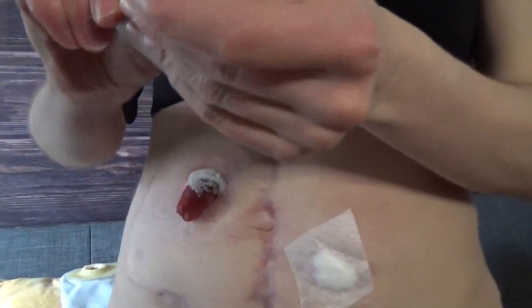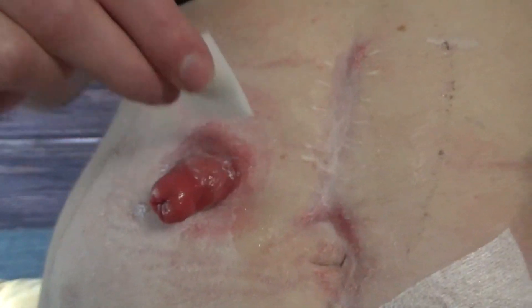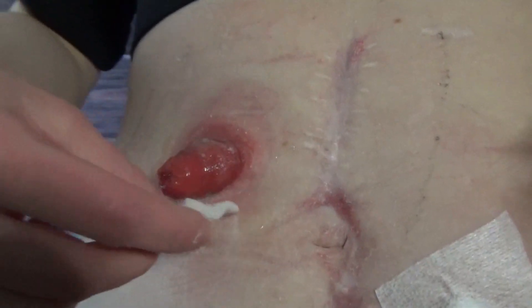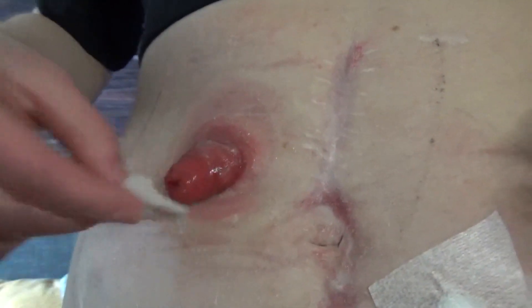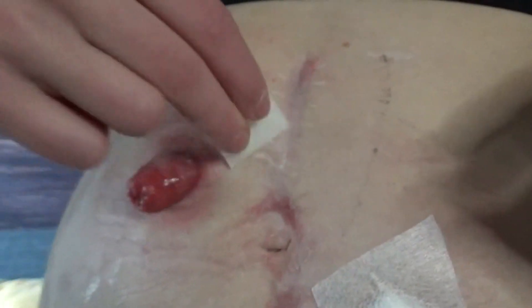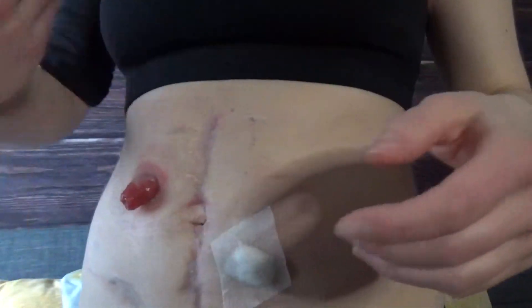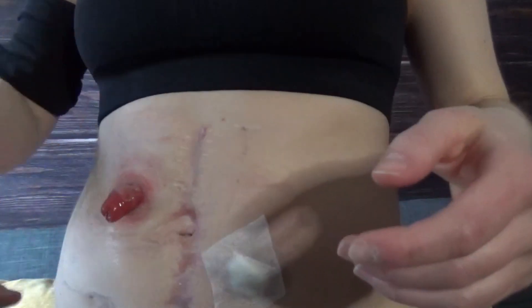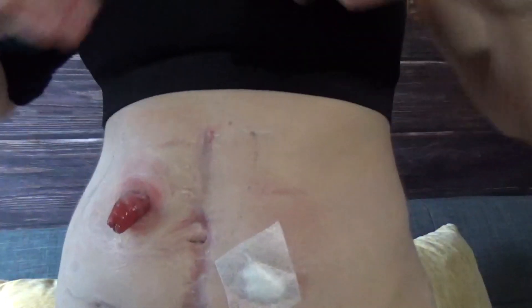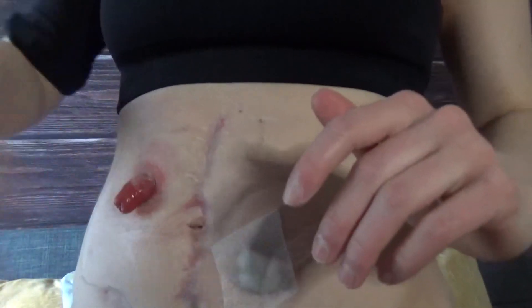Brush off the excess powder from your skin but keep it around the peristomal area — it will provide more dryness for a better barrier stick. Now go in with the Calvicon barrier film and tap it on lightly. You want to get it moist enough to make that powder nice and almost pasty, but not overly saturated. This stuff tends to dry really quickly, and you want it fully dry before putting on your bag. If it's not dry, your bag will not stick properly — bags are really built to stick to completely dry skin.